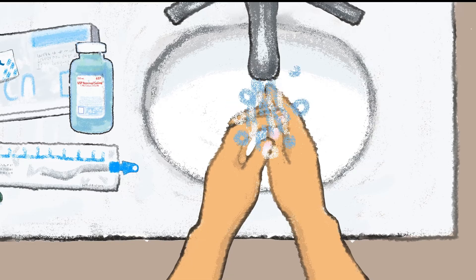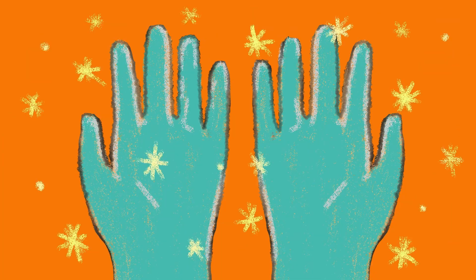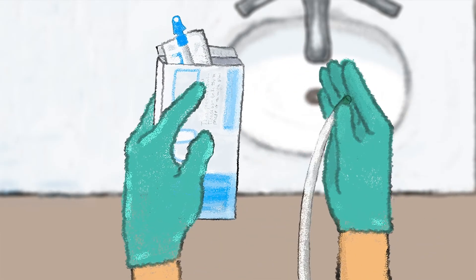I always wash my hands before I start. I put on gloves if they come in the kit. What's inside the packaging is considered sterile or clean, so I only touch these supplies when I have gloves on.